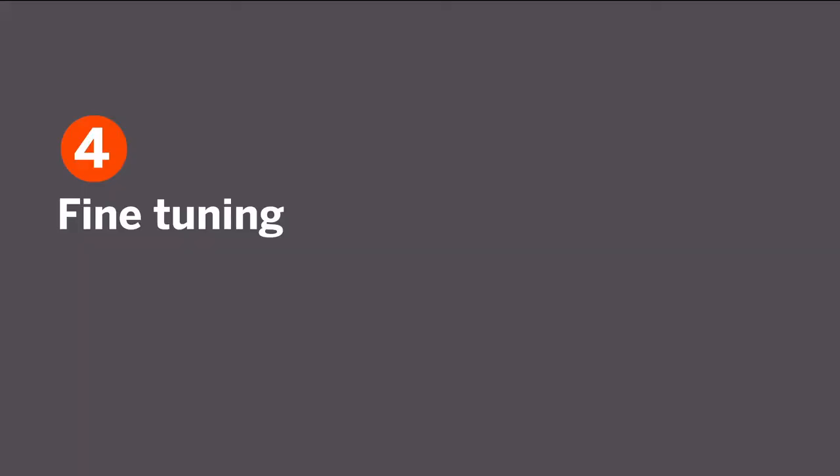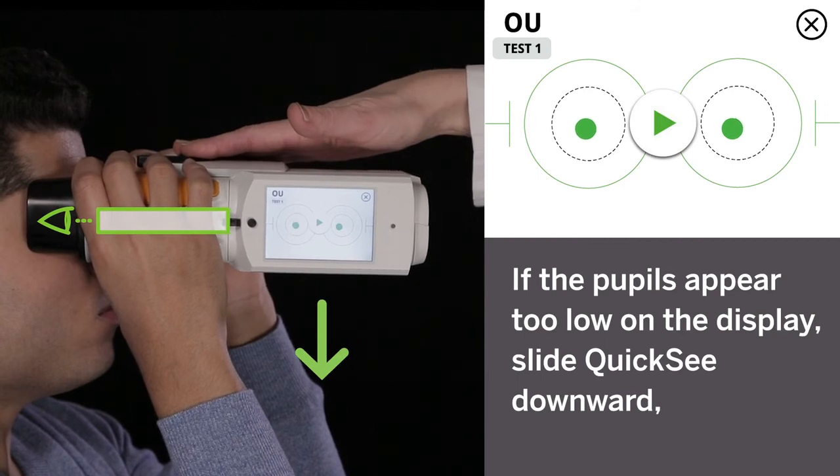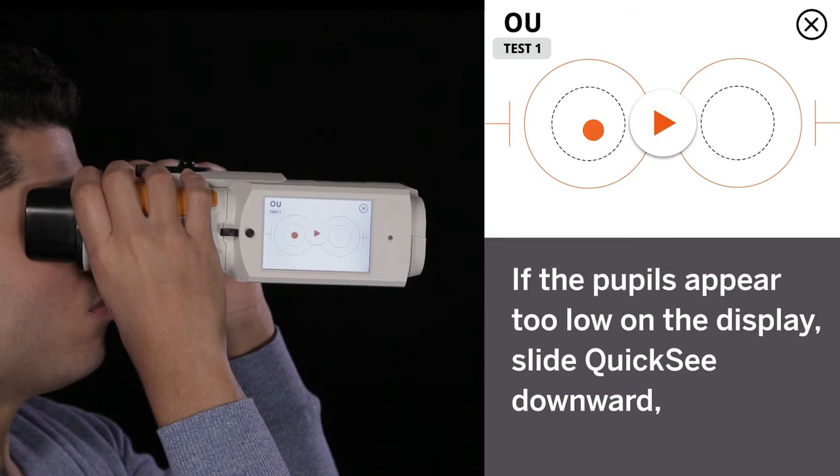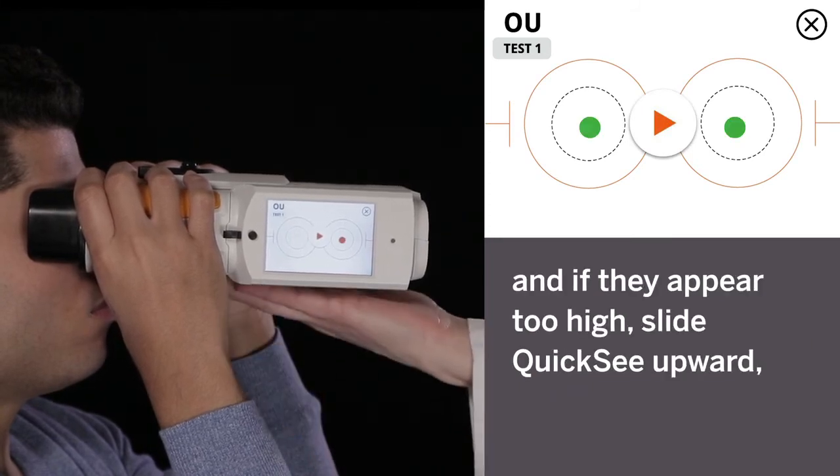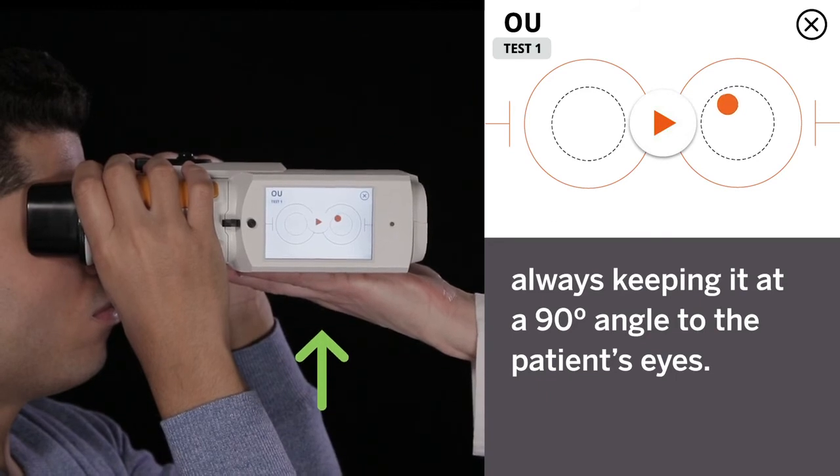Fourth, fine-tuning. If the pupils appear too low on the display, slide QuickSee downward. And if they appear too high, slide QuickSee upward, always keeping it at a 90-degree angle to the patient's eyes.